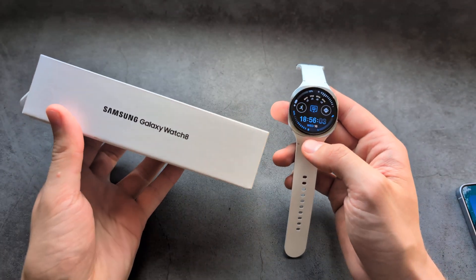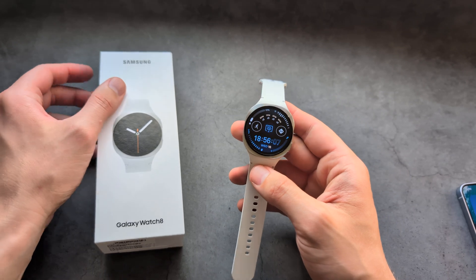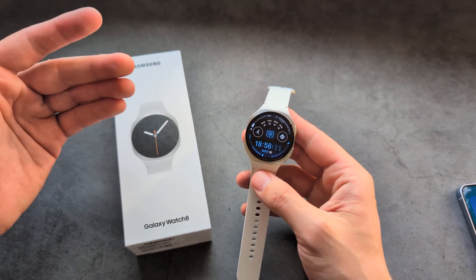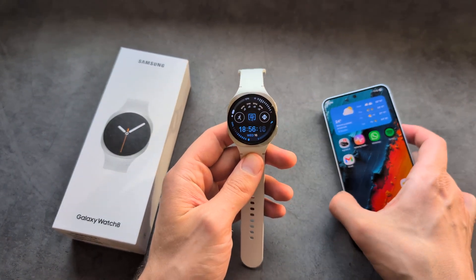Are you wondering if the Samsung Galaxy Watch 8 can detect sleep apnea? I have some great news. If you live in one of the supported countries where this feature is approved, and you pair this watch with a Samsung phone, you can actually measure it.